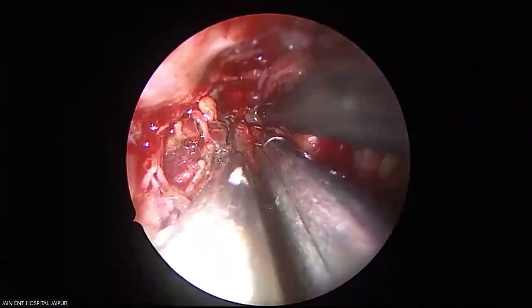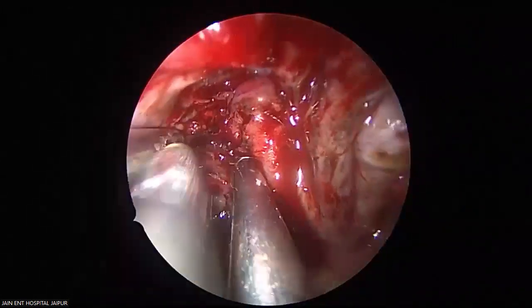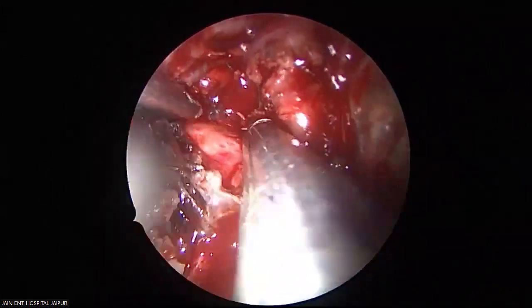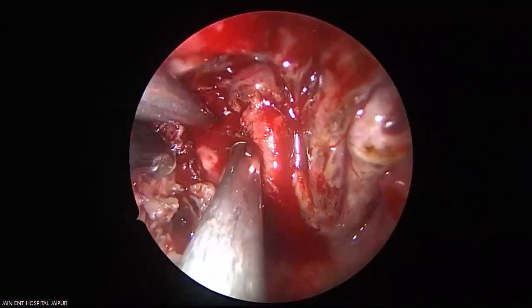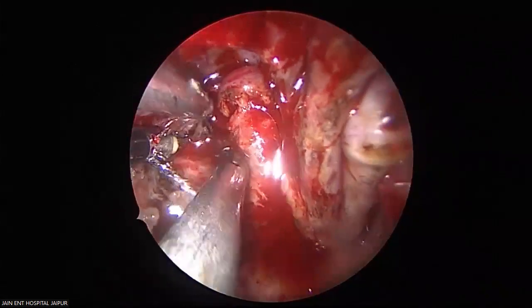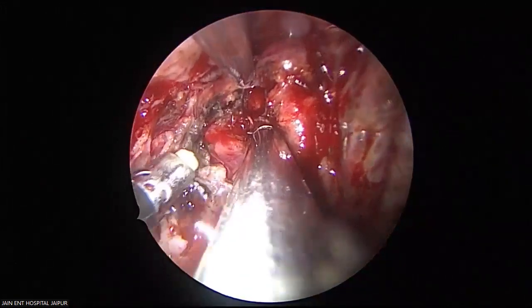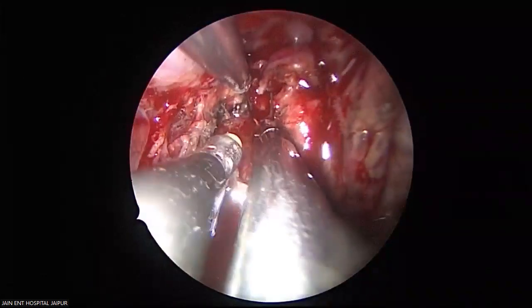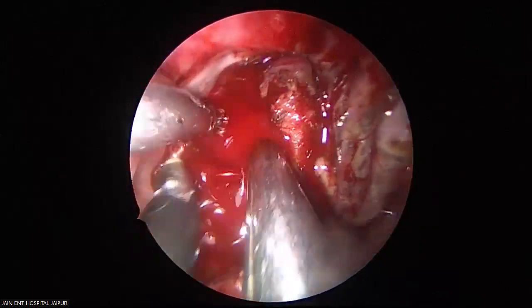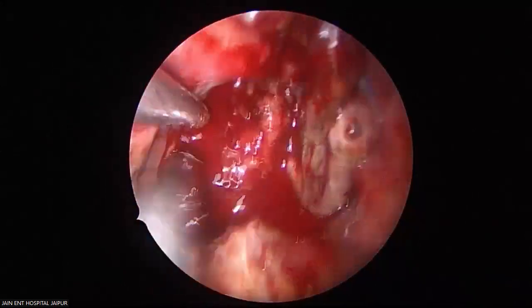Use tumor mass, use bulk. That is the surface of the tumor. When you look for it, widen more and more surface. When you widen more and more surface, you get more space. See, one of the branches. This is one of the branches.